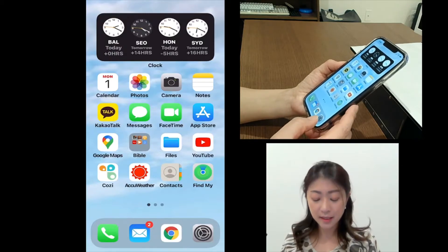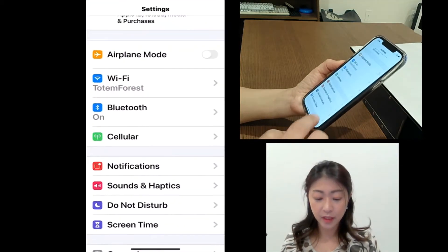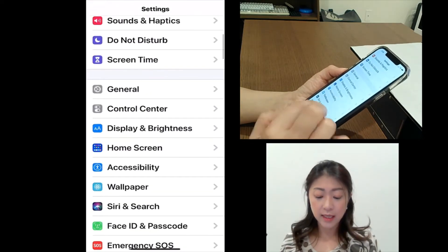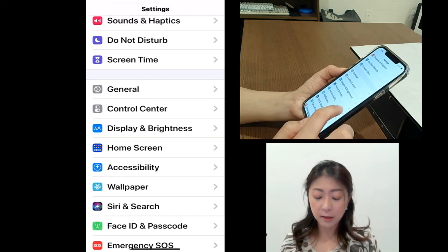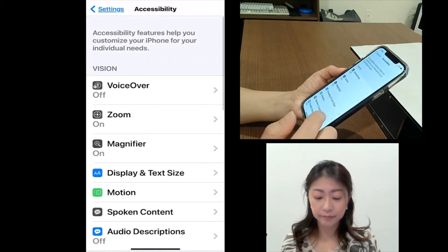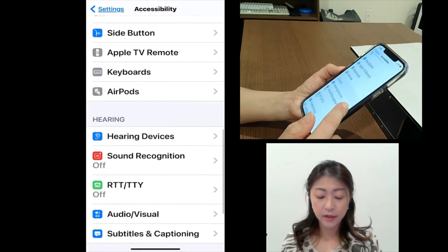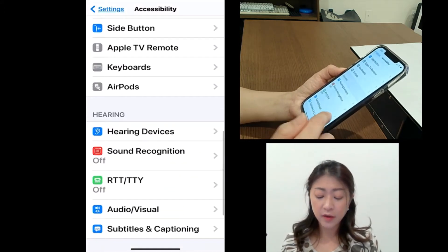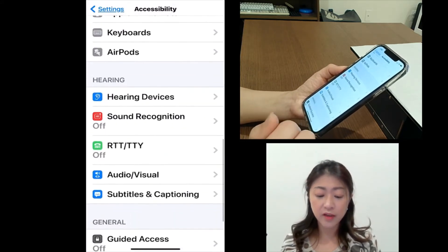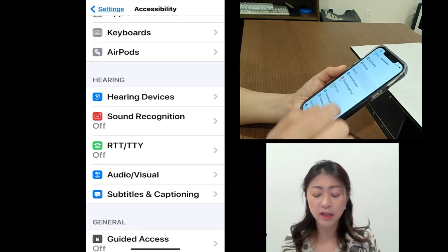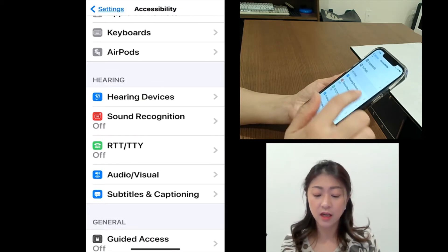Go to Settings, and then Accessibility, and then under Hearing, the first thing you'll see is Hearing Devices.